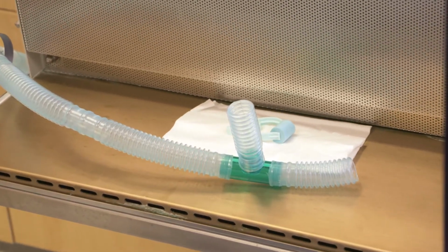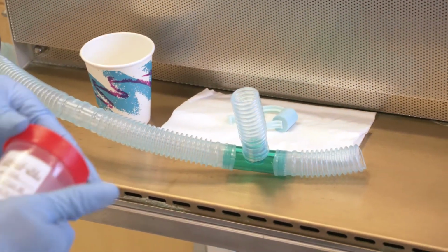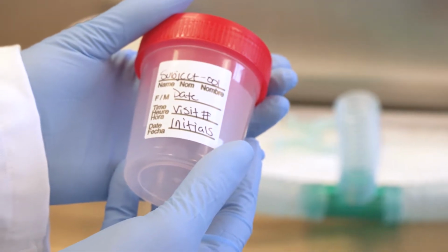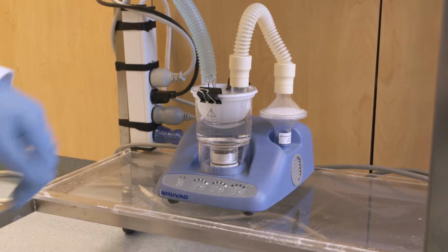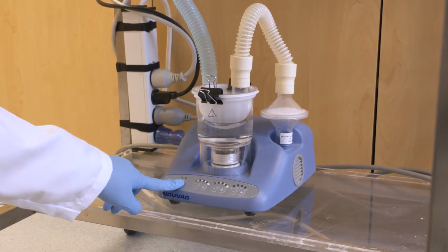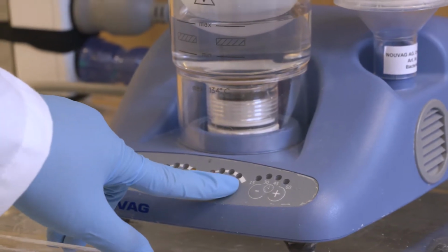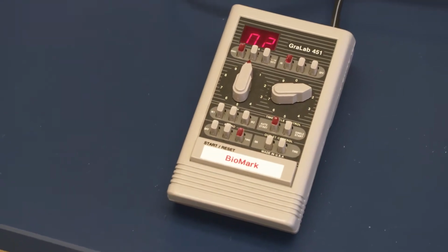Place a cup in the booth for saliva and a sterile specimen cup for sputum collection. Label the cup with the participant's initials, ID number, date, and visit number. Make sure there are some tissues for the subject. Check that the equipment is working before you begin. Set the nebulizer for maximal air and maximal flow. Set the timer to beep every 2 minutes.